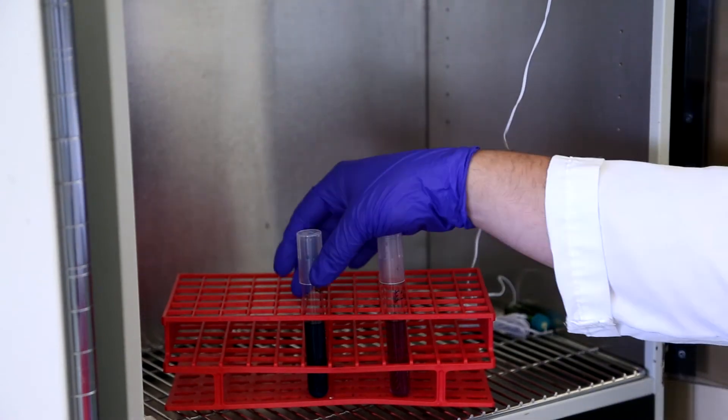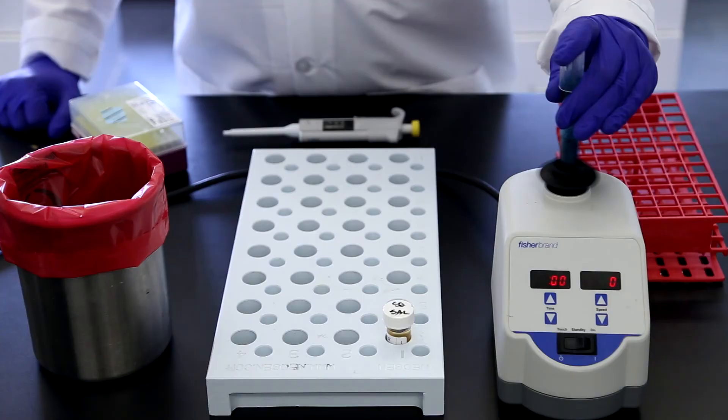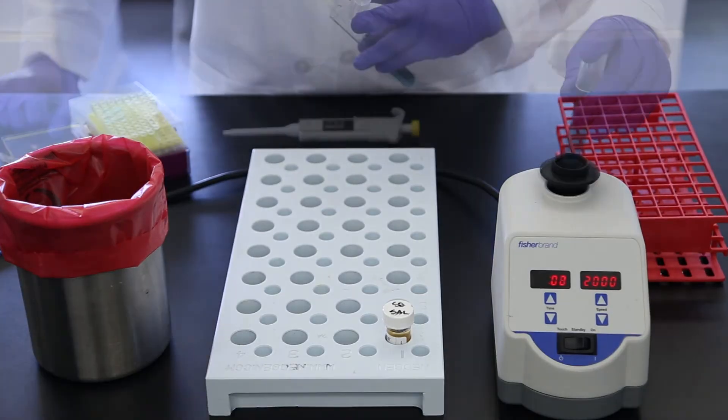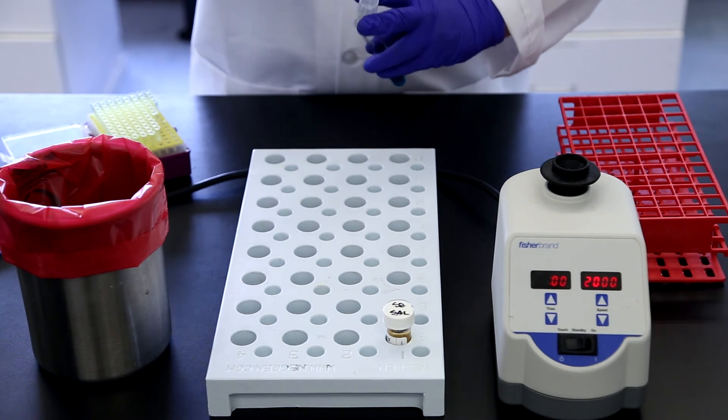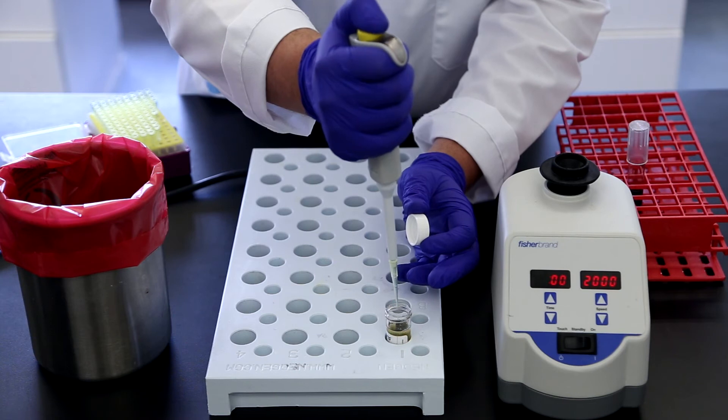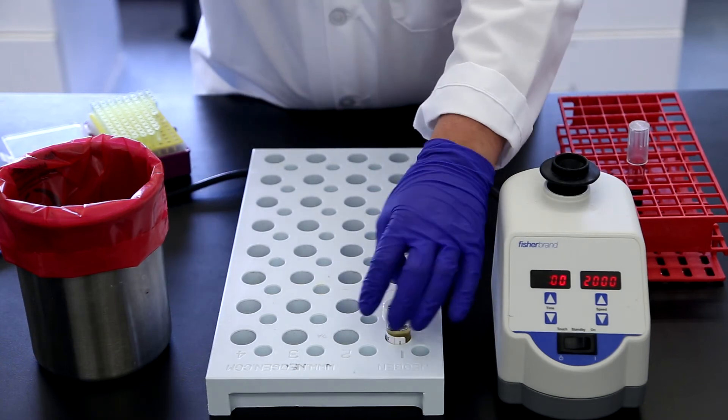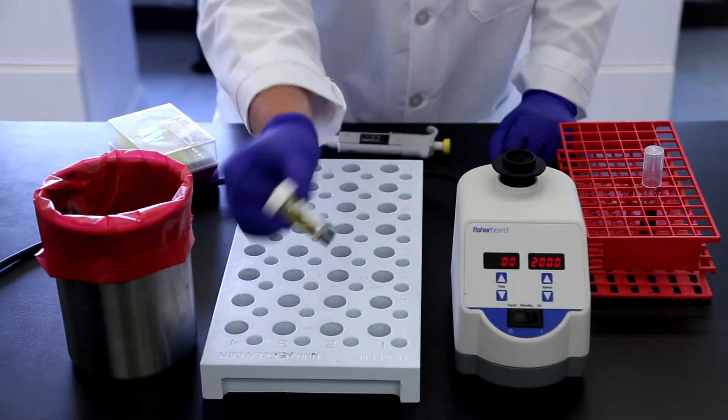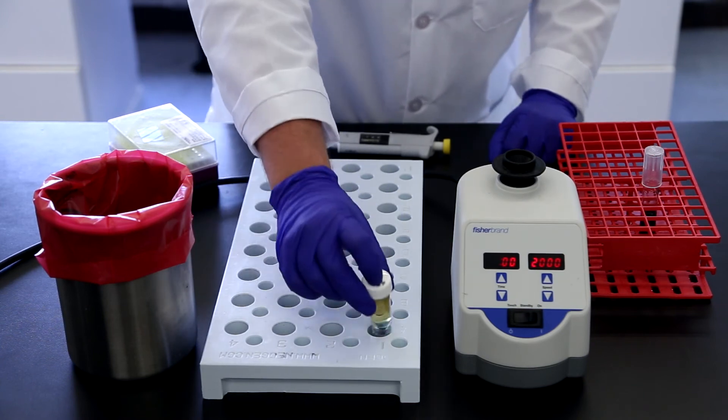Remove the RVS secondary enrichment from the incubator and mix well. Transfer 0.1 milliliters to the S2SAL vial, and gently invert the vial three times and place back into the vial rack.